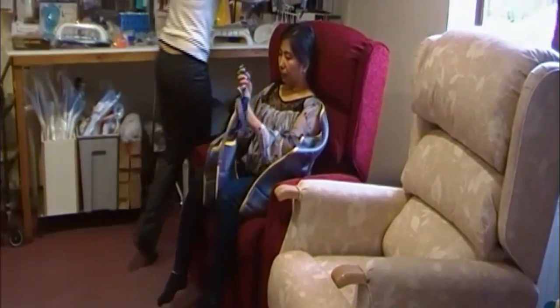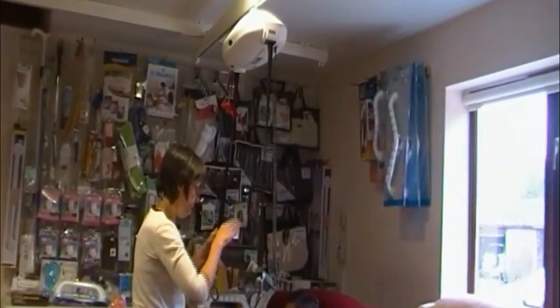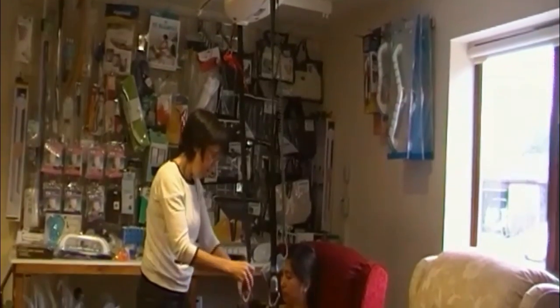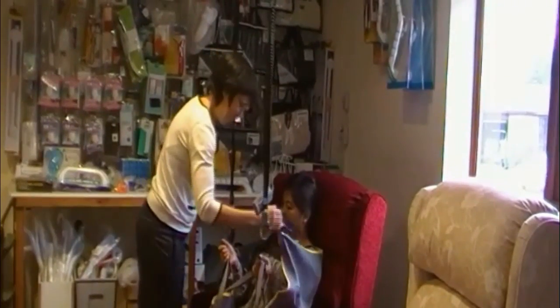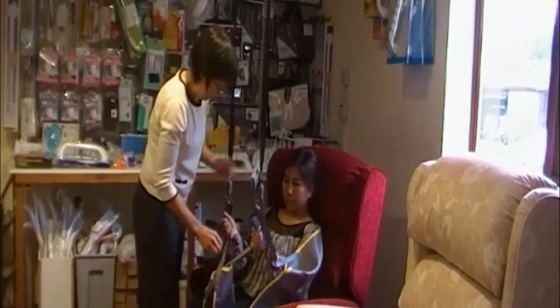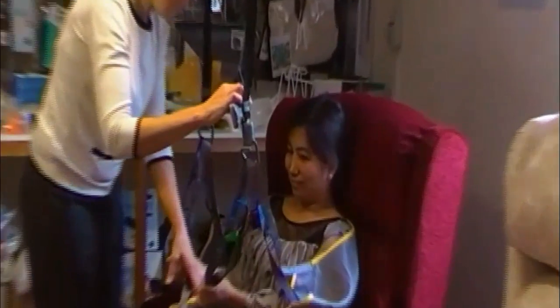Okay, now I'm going to bring the hoist along. There's no boom to bang your head on, so you don't need to worry about banging your head. I'm going to lift you up in a semi-reclining position, and then you'll be in a good position to sleep. There we are. Put those on here. You'll feel slightly strange, but we'll be in a good position to put you onto your bed.